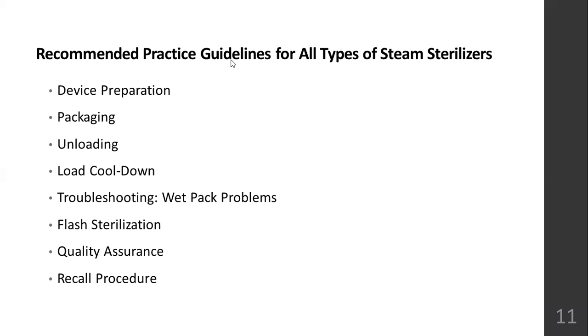These items have to be recalled back to the CSSD because the sterilization procedure was not efficient. The nursing superintendent will send this message out to all the staff nurse in charges. The staff nurse in charges of different wards will go through their sterile packs.